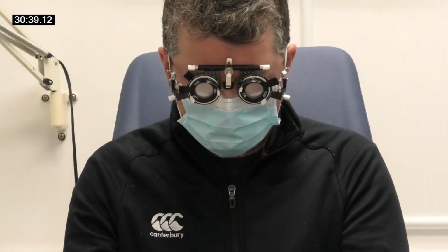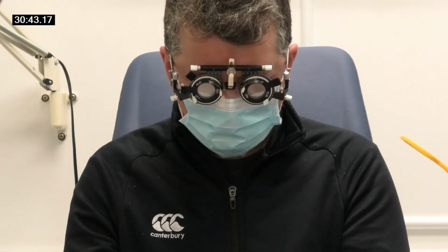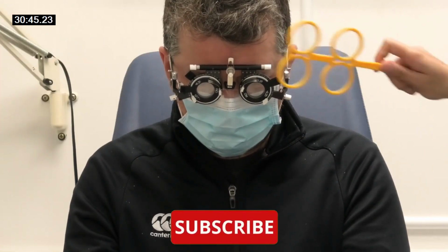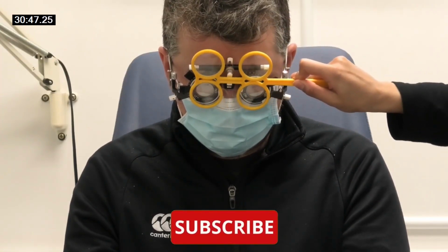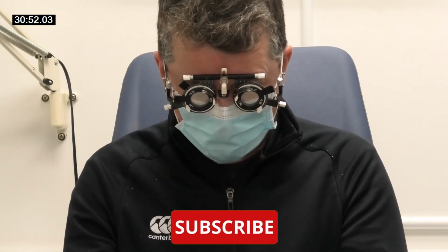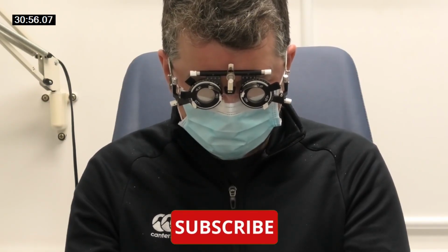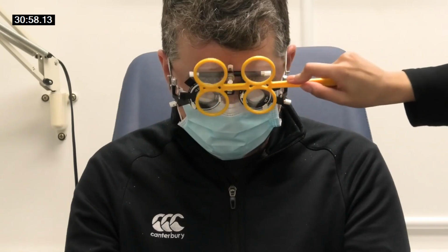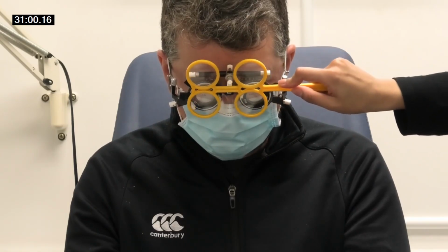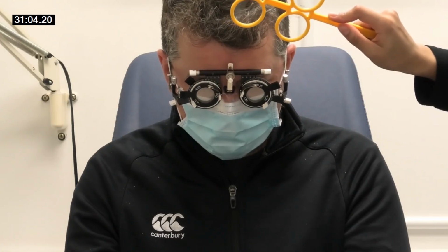Yeah? I mean, it's, yeah. That looks like a quarter. It's minus 50 in first. What happens if we put that one in? Didn't have a smudge on it. Better in or better out, or about the same? It's about the same. Yeah.